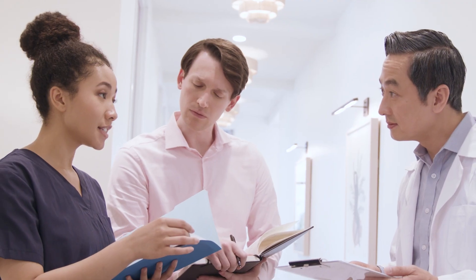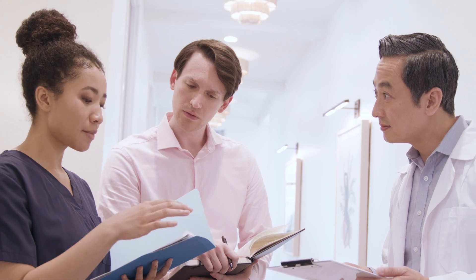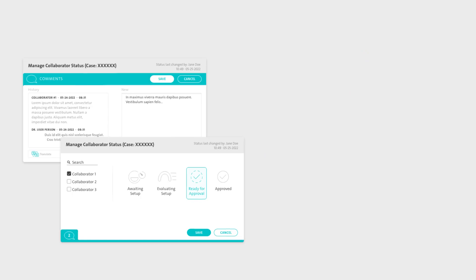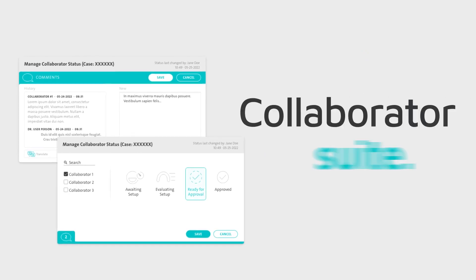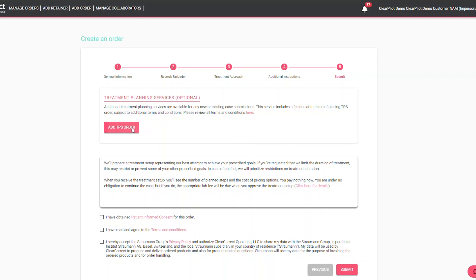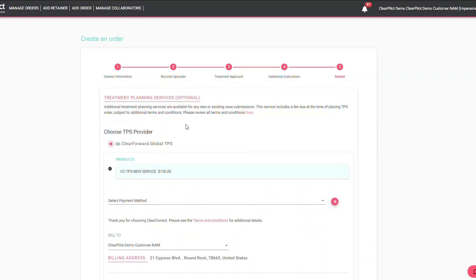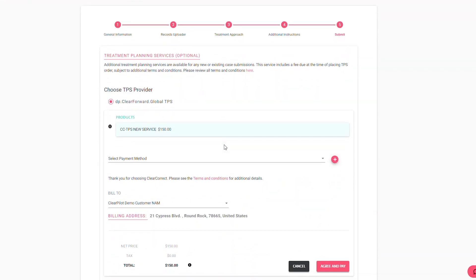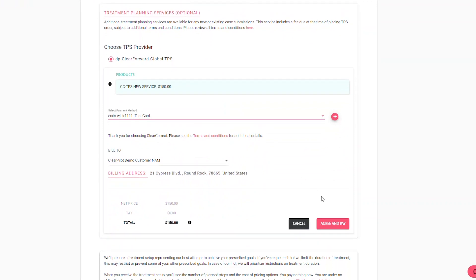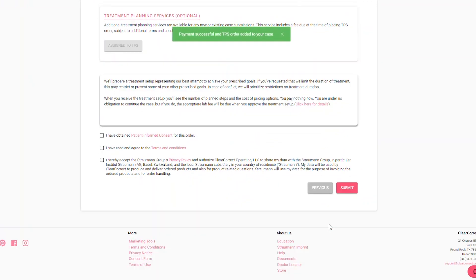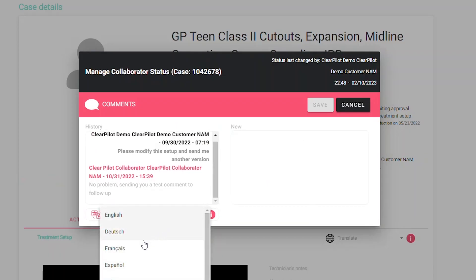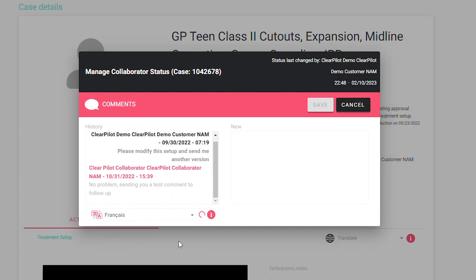Effective teamwork is essential to a successful ortho practice. That's where the Collaborator suite comes in. With Collaborator, you can easily discuss and share cases with colleagues or collaborate with external treatment planning services experts to achieve optimal treatment setups so you can spend more time with patients.